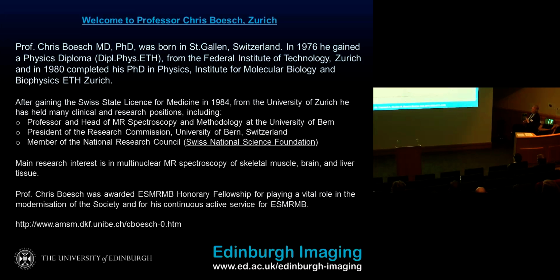One of the problems, but I think that will be solved soon, because say never in MR, because always someone is ingenious enough to find a way, is that the timing is actually a little bit a problem. In the Yale group, they were looking at glutamate when they were injecting labeled acetate, and that took minutes to hours until you have seen an effect, while hyperpolarization is gone after seconds. So we have this mismatch of the timing, but nonetheless there are attempts, and I'm sure that this problem can be solved. And with hyperpolarized carbon-13, there would be a great tool to study the entrance and the TCA cycle itself.